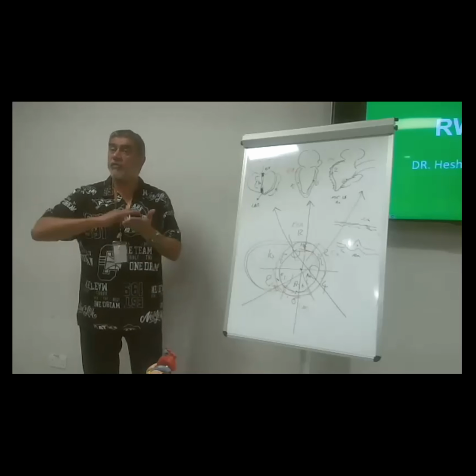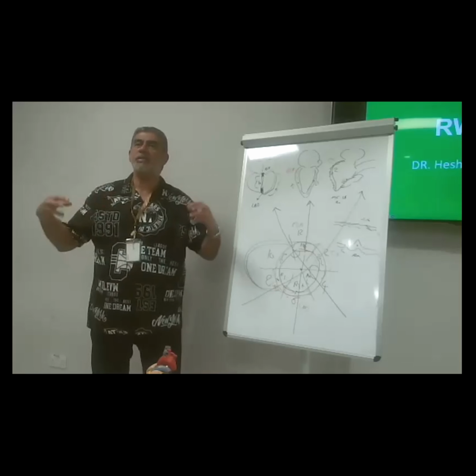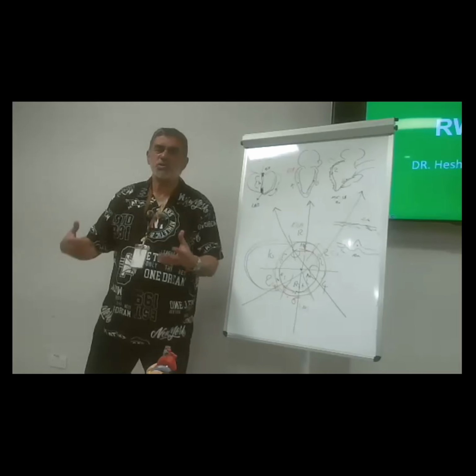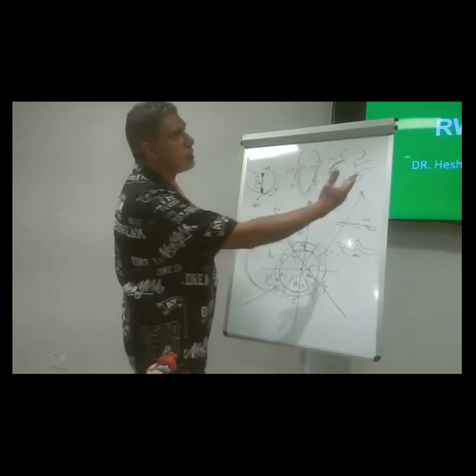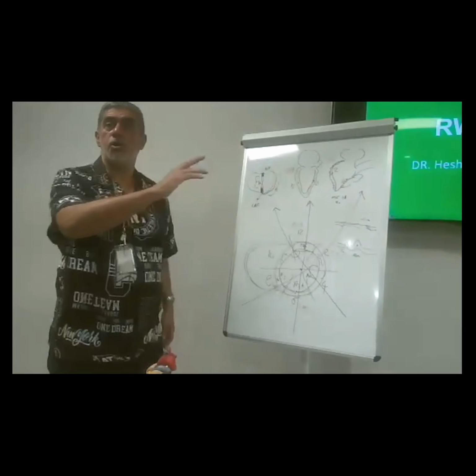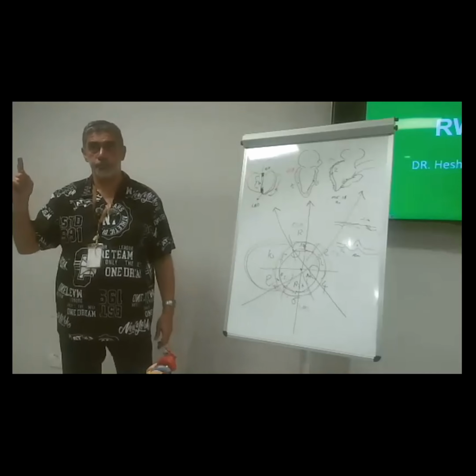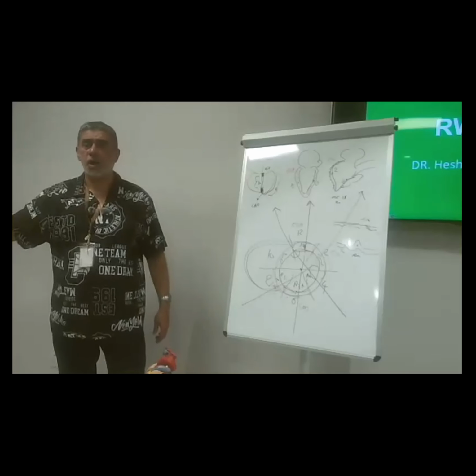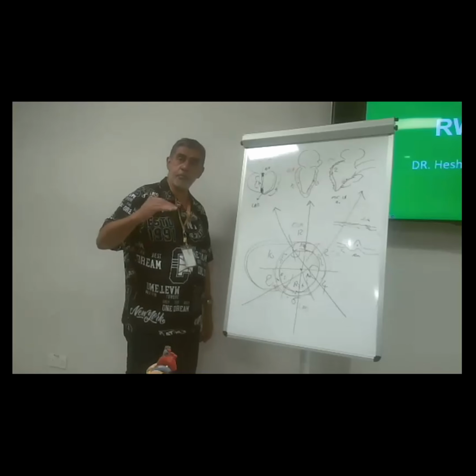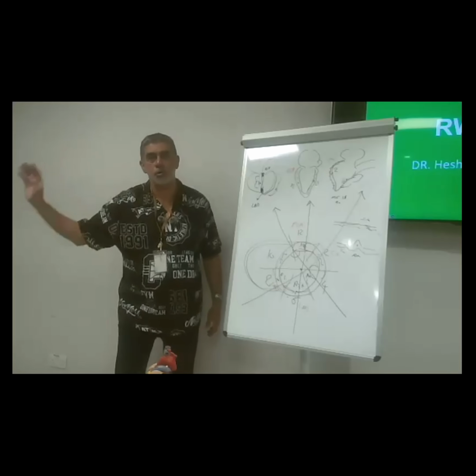Scan your patient, have a baseline, and then in the post-bypass time you can build over it and see if there is any change. That's why when we say RWMA, regional wall motion abnormalities, it's not only this, it's new regional wall motion abnormality. If you have an old one, I will not build over it. But you have to do a pre-bypass scan to have an RWMA, and in the post-bypass, you have a new RWMA. Okay?